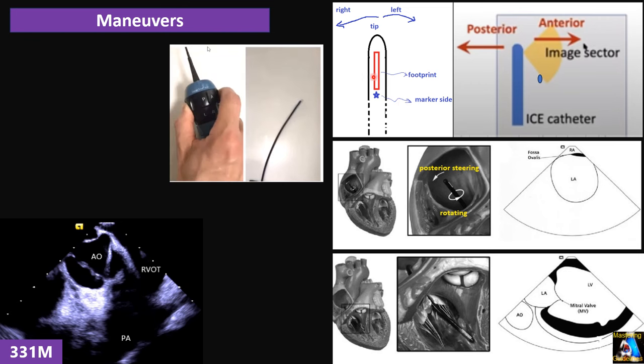Information about the anatomical characteristics and its variants that could represent obstacles for ablation are evaluated. In particular, its length, the prominence of the Eustachian ridge, presence of hypertrophic pectinate muscles and pouches. These findings help the operator define the best strategy and choose tools to overcome the anatomical challenges.